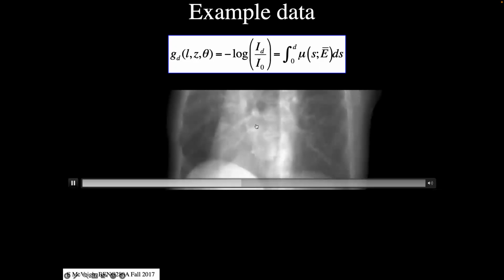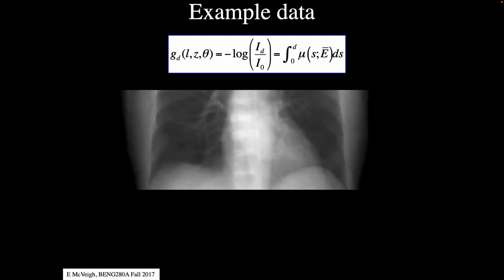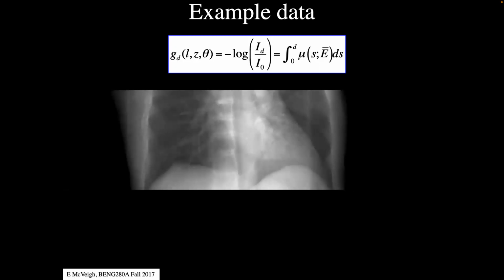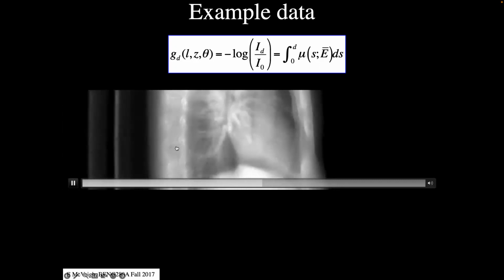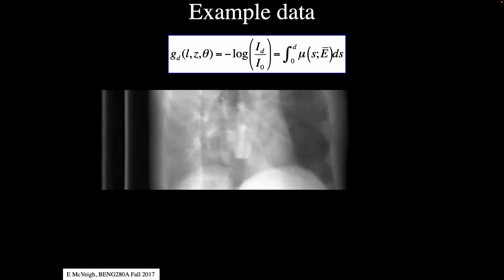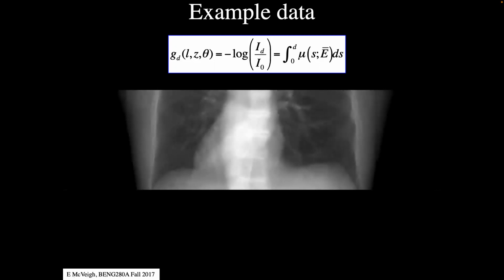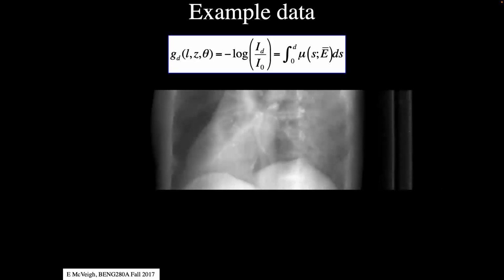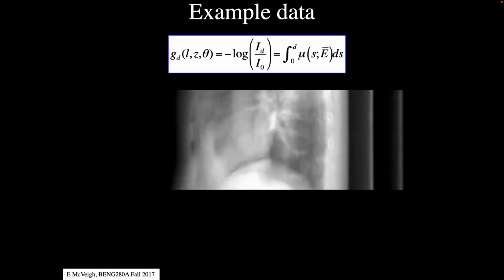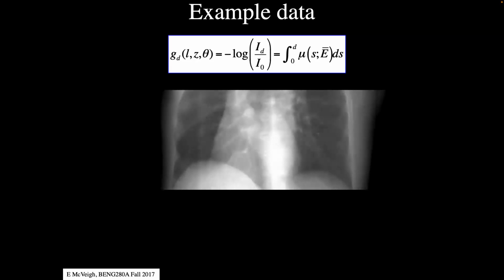That's just the same detector moving around. And if I put my cursor there on that point, that is the same detector element, right? It's just acquiring data tick, tick, tick, tick through time, right? This data is obtained at a reasonably fast rate. I mean, there's 1,000 projections done in about 140 milliseconds, probably, or even more.